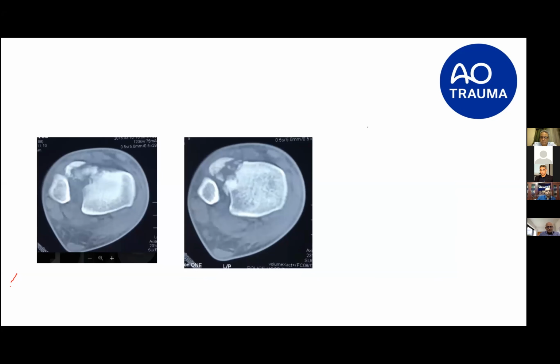The last thing is, sometimes in this case, if you open anterolaterally, try as much as you can, there's a fracture of the fibula. Sometimes, because there is a lateral talar shift, the deep part of the deltoid will be incarcerated and bent in. It will save you the time. You can open the deltoid immediately, take it out of the gutter, and then your reduction will be easier. This, for me, is the reason for adding an extra step in this specific situation.